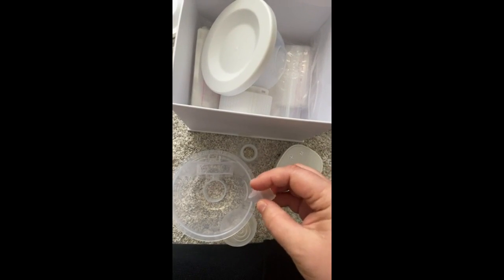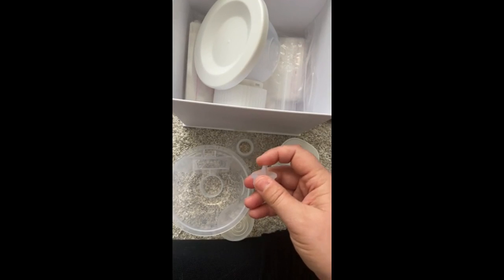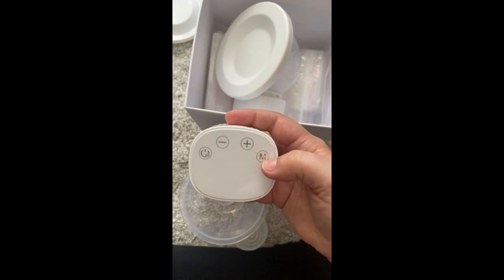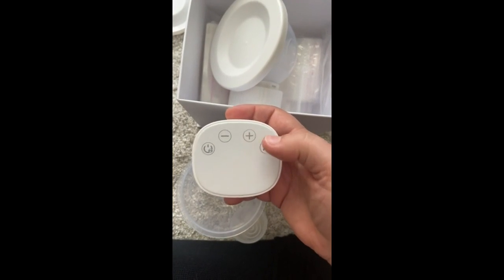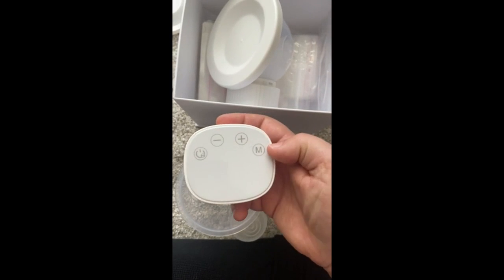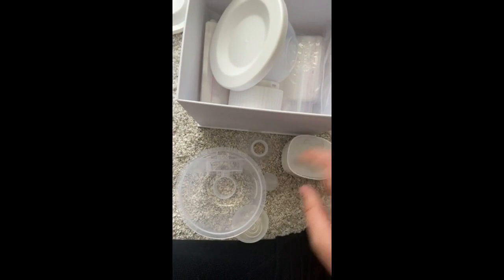And it's fine, but if your milk is already letting down and it's already flowing, then you want to increase that suction, and you have to manually change it. So you would manually change it once you see your milk letting down. Change it from stimulation to the expression mode, and you just hit this. I know with a Willow, it can tell on its own, and it just automatically switches over for you. Not a big deal, again, but just some small things that could be adjusted.